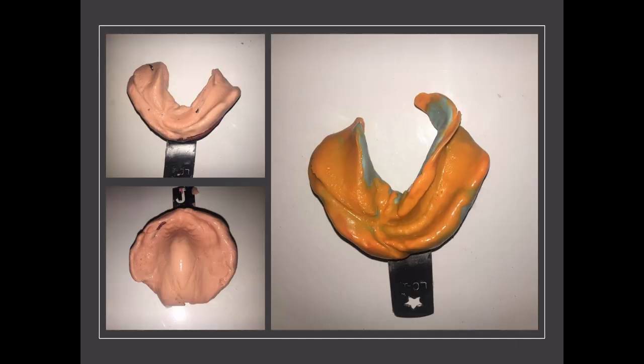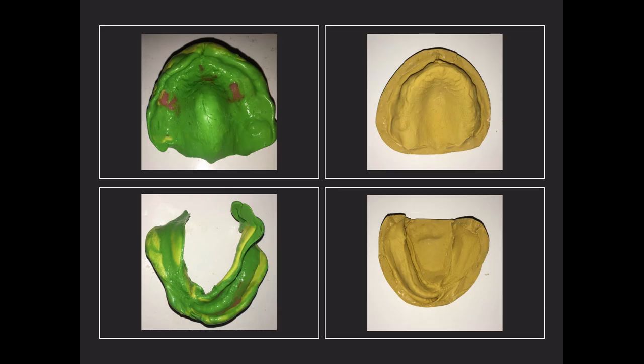Now these are the primary impressions. We know that retention in the mandible is achieved by close adaptation of the prostheses with the underlying surface and by extending the lingual periphery on the unresected side to the maximum extent. This maximum extension on the unresected side was better achieved using polyvinyl siloxane than alginate. These are the secondary impressions and the master casts.